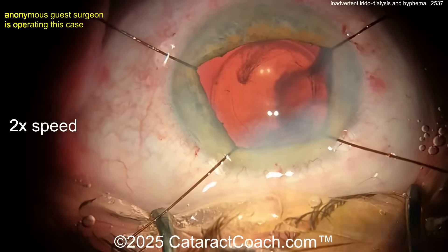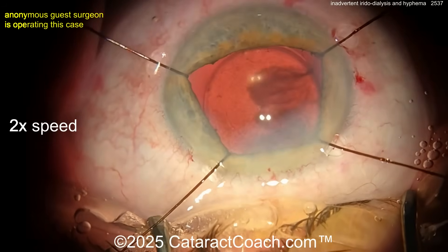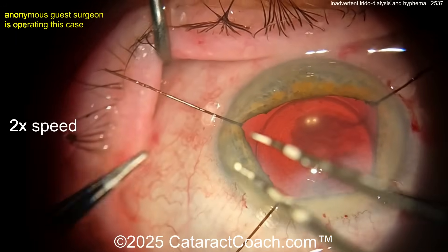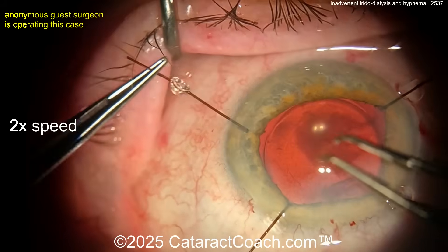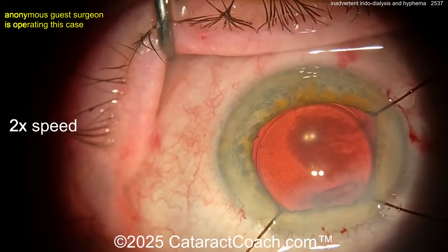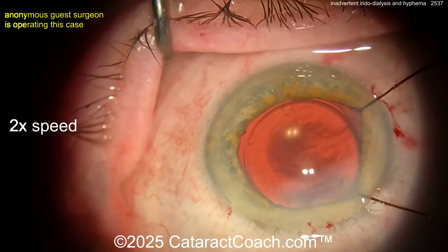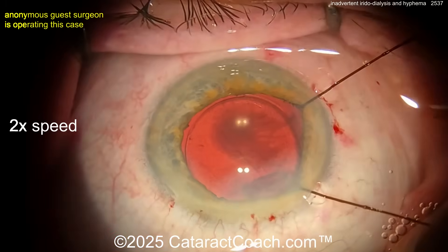What do you do now? I'd get the pressure up and take the iris hooks out — get the IOP up in the eye. Now look where the blood is going — it looks like it's gone to the anterior hyaloid face, Berger's space. Let's get these iris hooks out now. An easy way to get them out is to undo the collar and then just pull, but be very careful — don't pull on the iris.